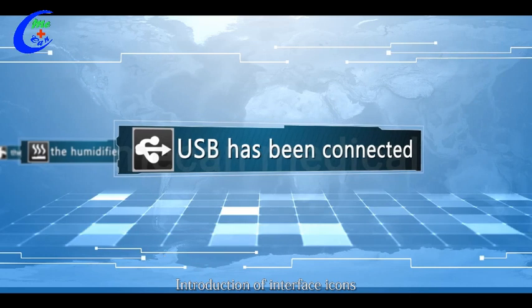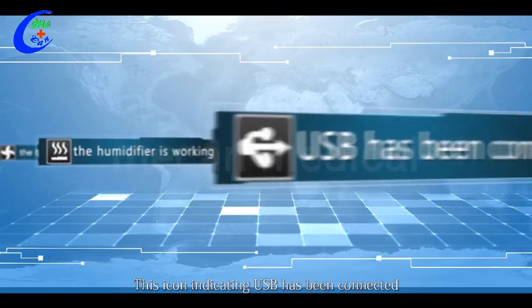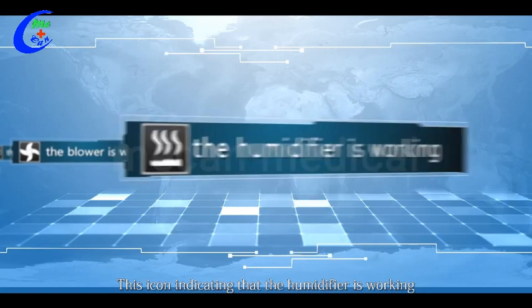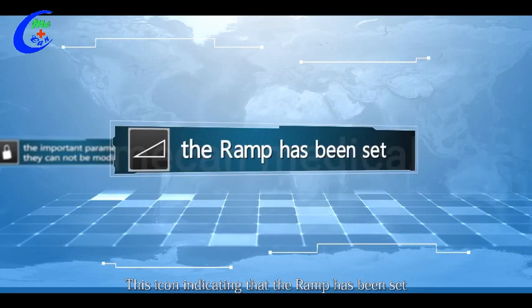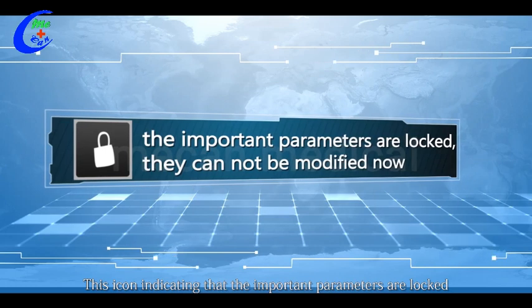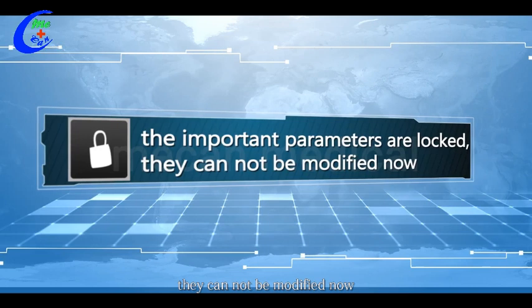Introduction of interface icons: this icon indicates USB has been connected; this icon indicates the humidifier is working; this icon indicates the blower is working; this icon indicates the ramp has been set; this icon indicates that the important parameters are locked and cannot be modified. Unlock steps: move the cursor to the parameter setting icon on the main interface and press and hold the shuttle button until you hear a musical alarm.